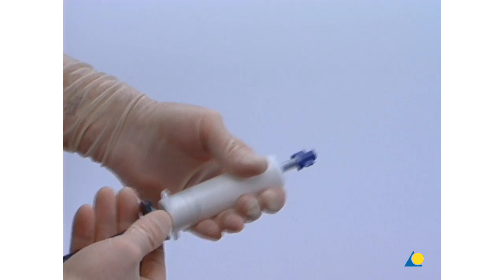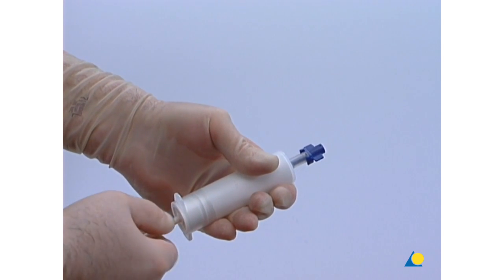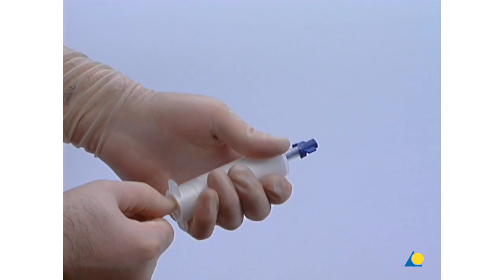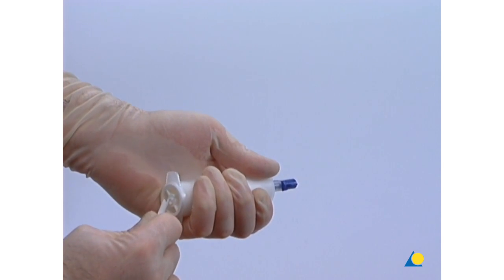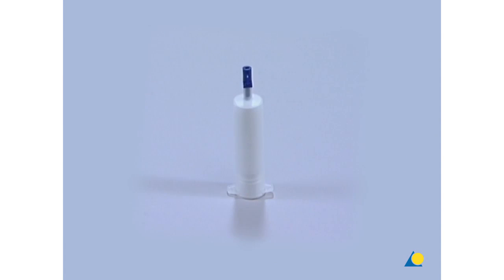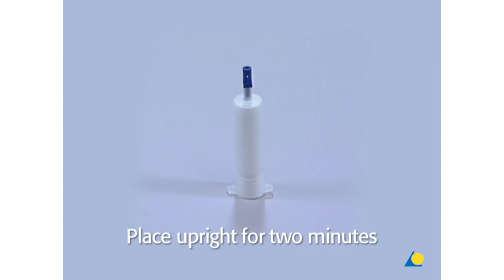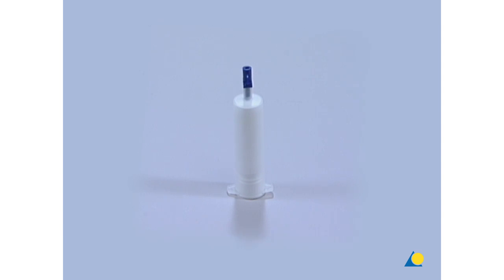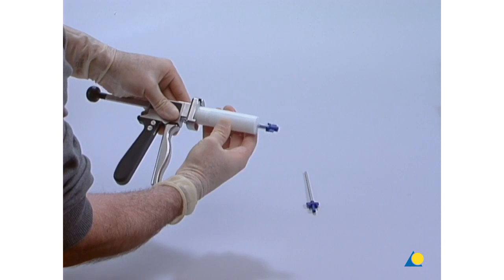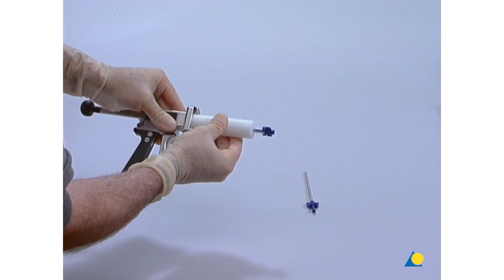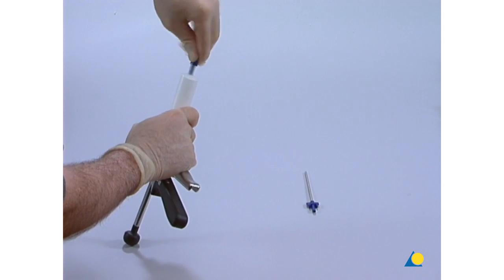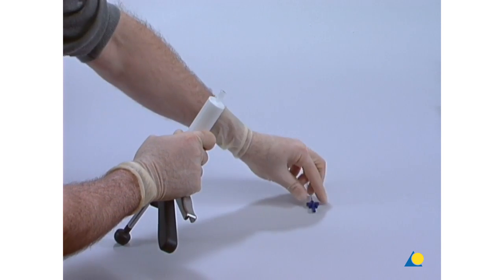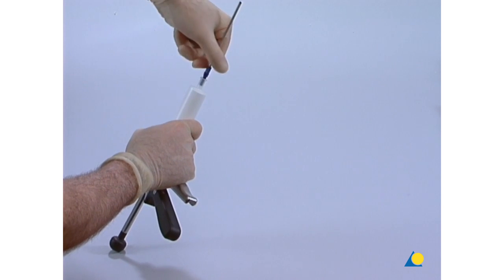After mixing is complete, the plunger is fully pulled out and snapped off. The cartridge is placed upright for two minutes so that air bubbles can escape. The cartridge is loaded into the bayonet catch on the delivery gun. The blue sealing cap is removed and the appropriate injection cannula is mounted.